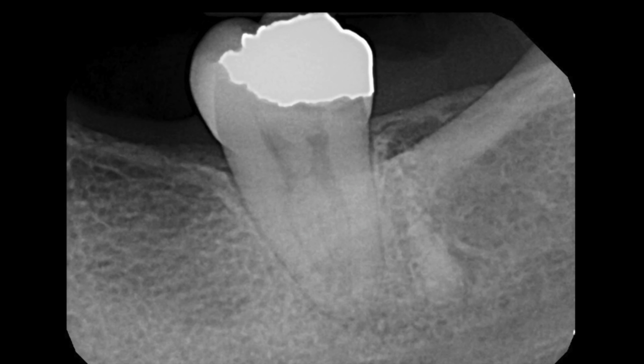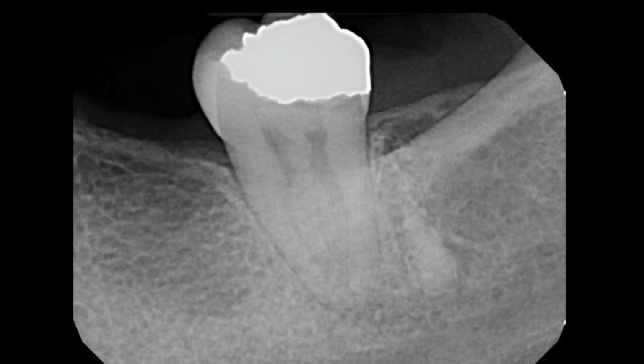So I'm going to share with you this case. It's a mandibular second molar that requires root canal therapy. It has irreversible pulpitis. We've given the conventional block and the ligamental shot as well in these types of cases until I have a negative cold response on my vitality testing. Repeat before I get started. So I get the tooth started.